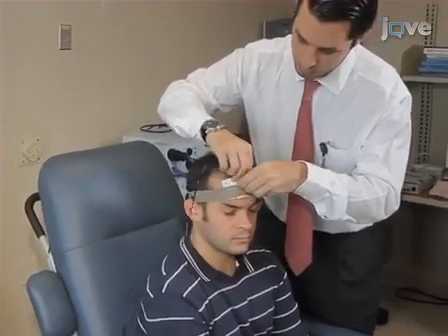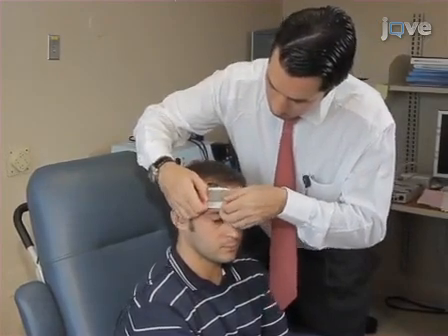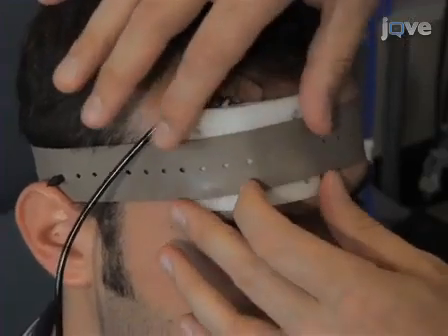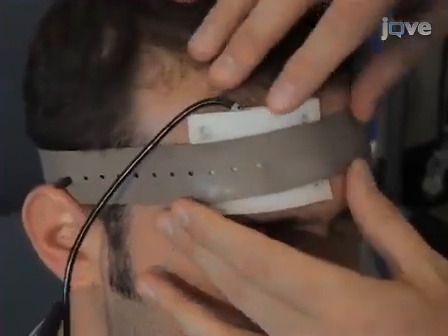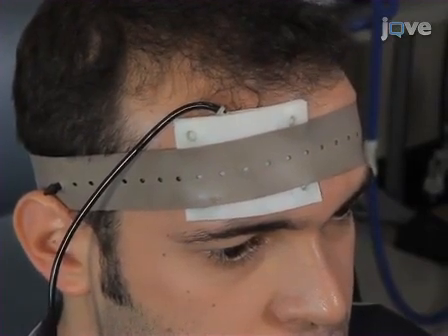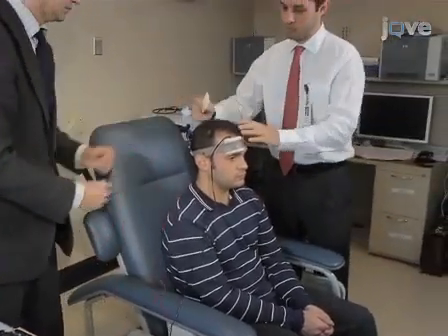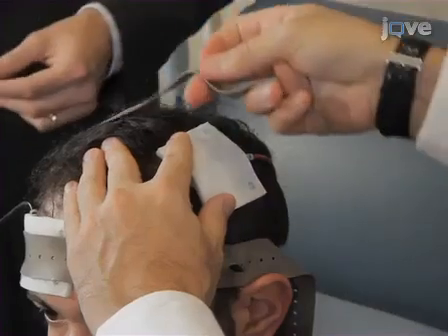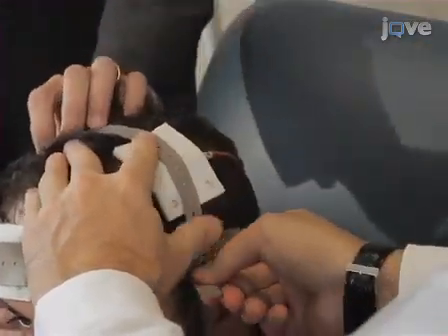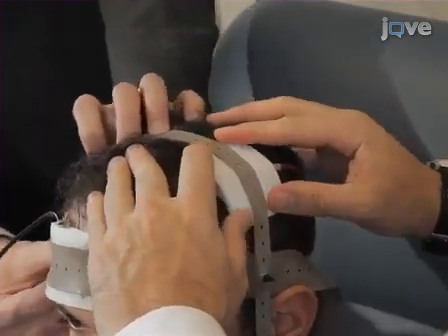Now, place the sponge pocket holding the cathodal electrode underneath the elastic head strap. Here, the sponge is placed over the supraorbital region. Take care that excessive fluid is not ejected from the sponge onto the scalp, as this will spread current flow across the scalp during stimulation. Connect the second elastic head strap to the first according to the desired electrode montage. The sponge holding the anodal electrode is placed under the second elastic head strap over the M1 location.